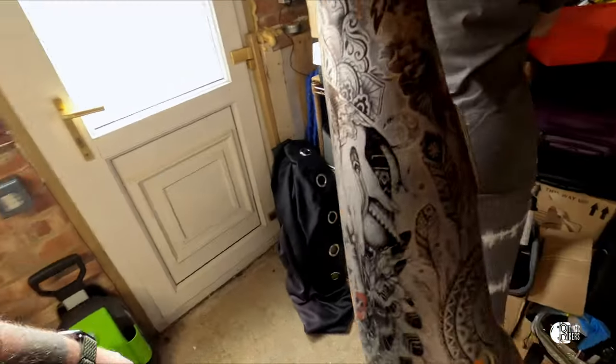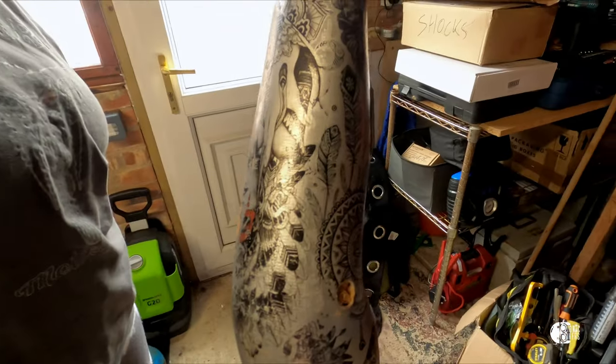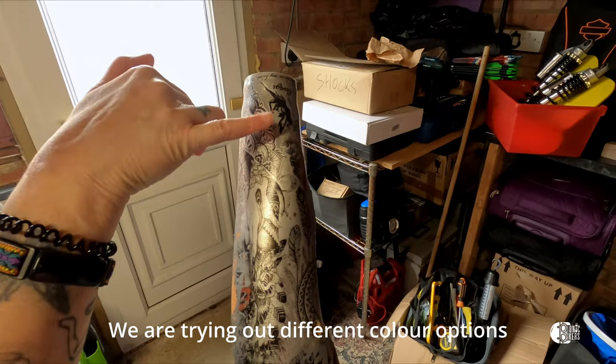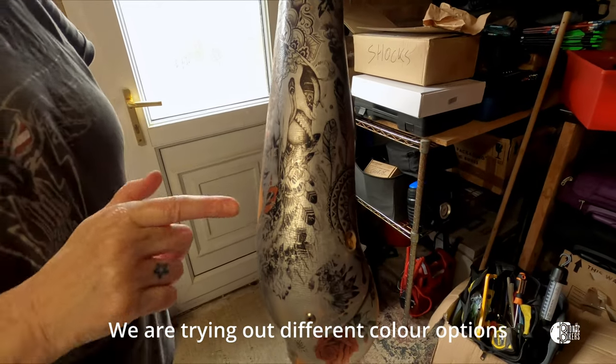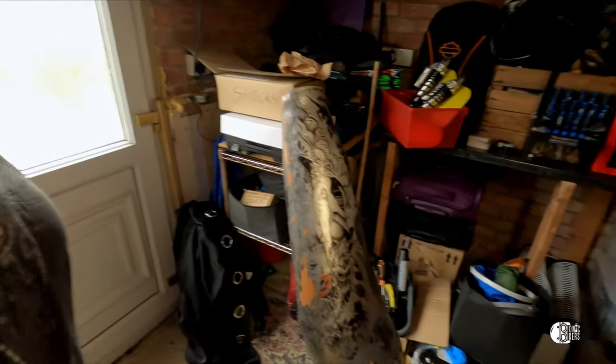So here's the old arm. This is the bit you're going to spray where it's got the black on it, because it's all rubbed off everywhere, so we can redo this arm. Hold that then.